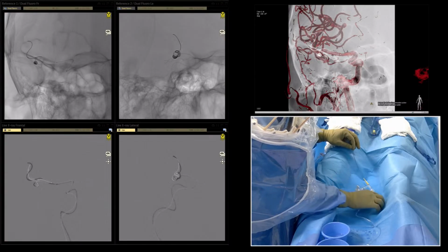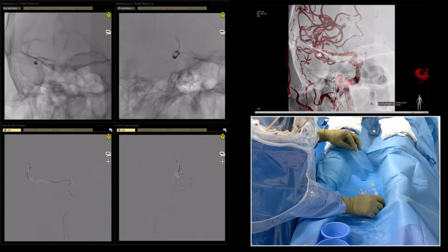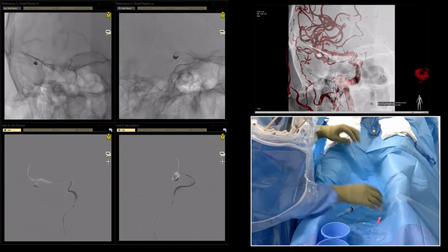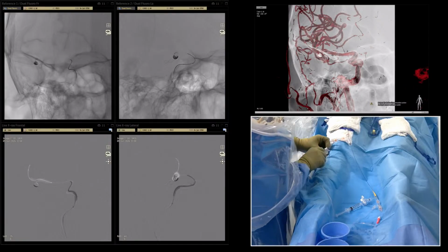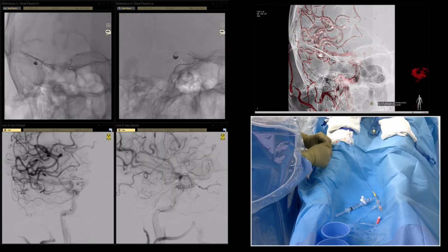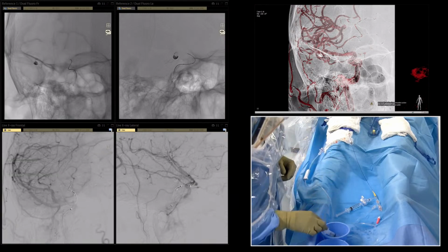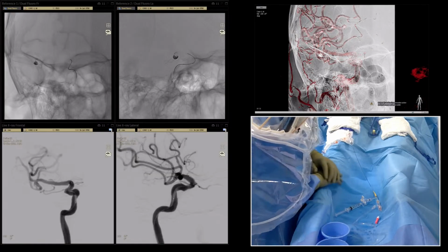I'm just trying to convert the half-T stenting to C-stenting. It's not possible in every case, but I'm trying. Okay. It's not moving. Yes, we can leave it like this, no problem. The stent is opened. It's like a parallel channel in the artery.